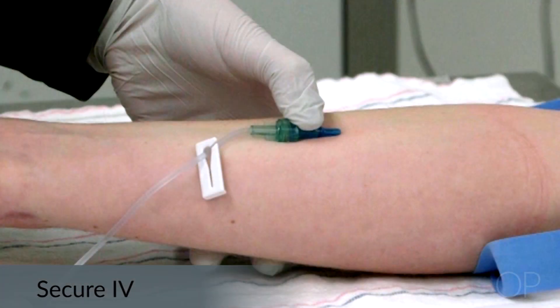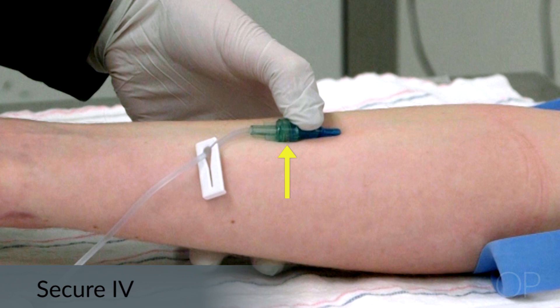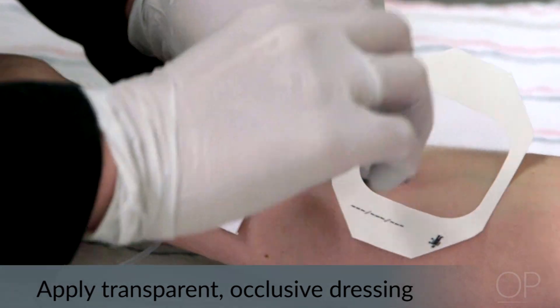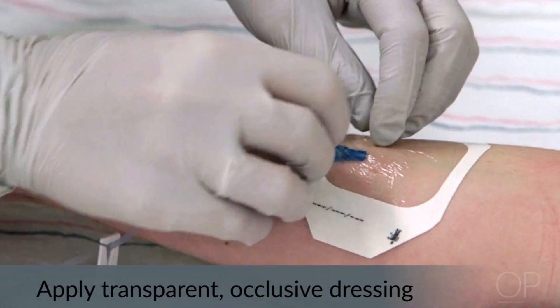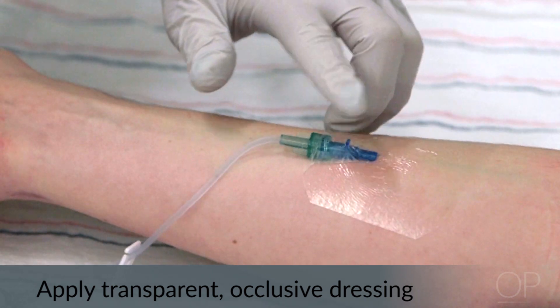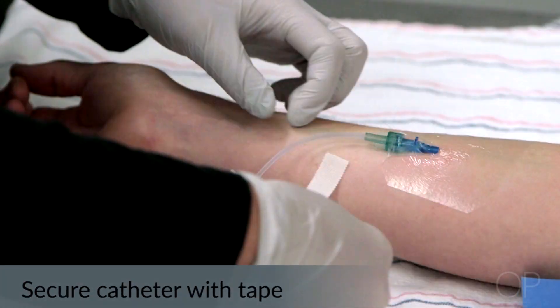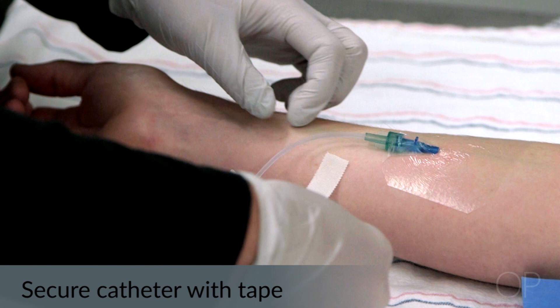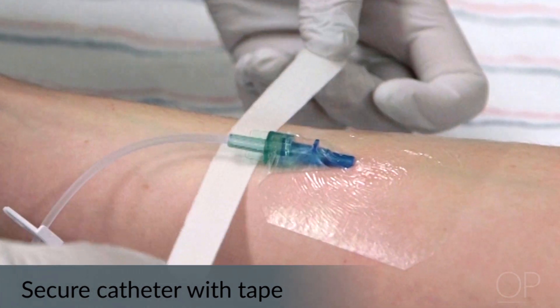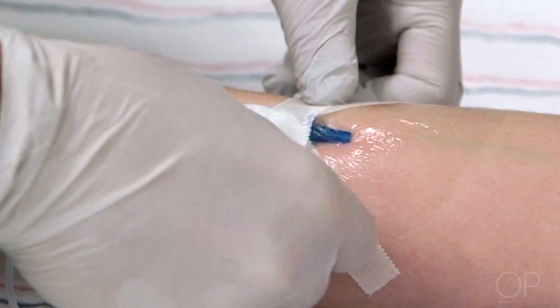To secure the IV: if the T-connector has a metal or thick end, place a piece of gauze under it before putting the dressing on to protect the skin from breakdown. Dress the site with a transparent occlusive dressing, making effort not to cover the insertion site with anything opaque so the site can be monitored for infiltration or phlebitis. Assess again for patency by flushing and clamp the T-connector. Secure the catheter with tape using the chevron technique: take a half-inch piece of tape adhesive side up, slide it under the hub of the catheter, and cross the tabs over one another adhering them to the patient on opposite sides. When necessary, use a second piece of tape to secure the attachment device.